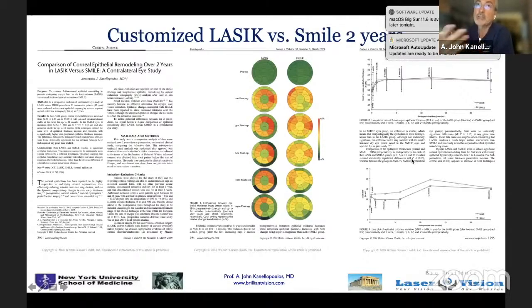about before, that addresses cornea astigmatism and cornea coma and lines up the cornea optics to the vertex of the eye. Plus the fact that the laser with a platform such as the Alcon platform has cyclorotation adjustment, which for astigmatism is very crucial. SMILE up to the point is not able to cyclorotate and adjust for axis of astigmatism and cyclorotation, and thus it's expected to have inferior results when we're correcting cylinder.